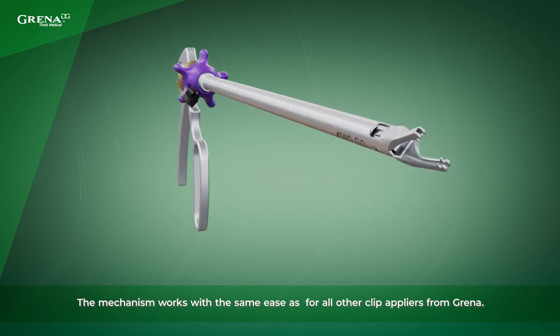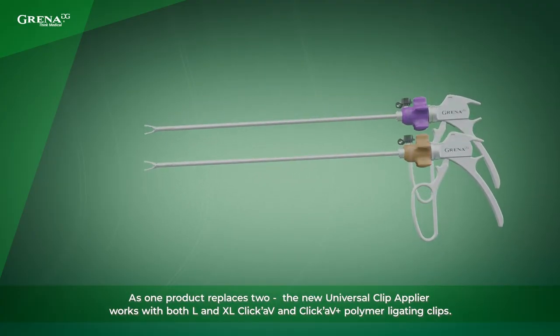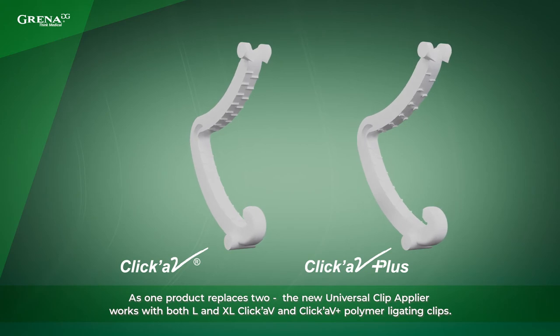The mechanism works with the same ease as for all other Clip Appliers from Grenna. As one product replaces two, the new Universal Clip Applier works with both large and extra large ClickAV and ClickAV Plus polymer ligating clips.